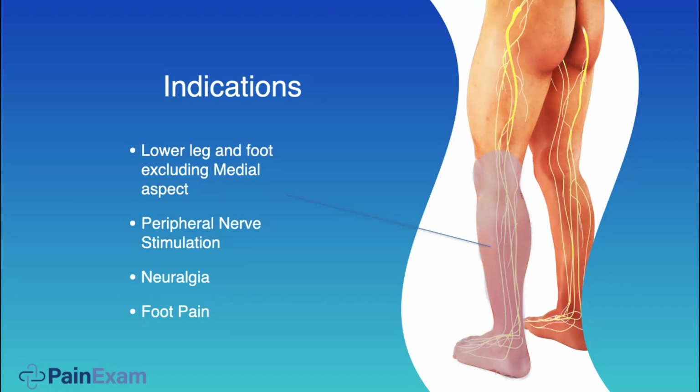I'm not aware of any study or evidence base to support ER doctors doing this particular block. Unlike with the hips, where there is evidence to support ER doctors doing fascia iliaca blocks, and in some cases femoral nerve blocks. However, if a patient comes to the ER and you're considering admitting them over sciatica, especially in this day and age with a coronavirus pandemic, and you don't want a high-risk patient, maybe elderly, to be in the hospital, it's also probably cost effective.